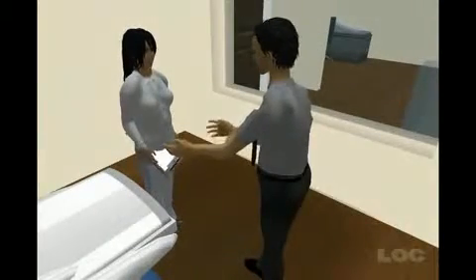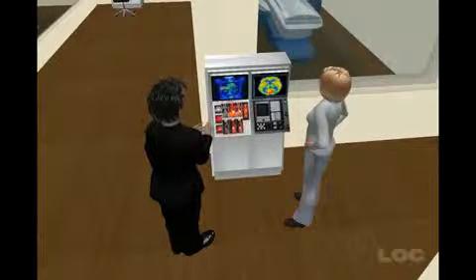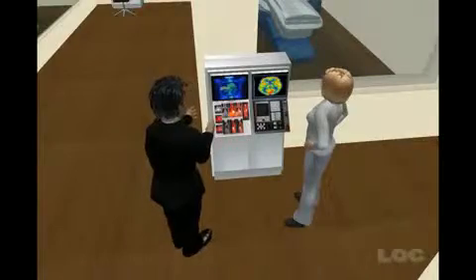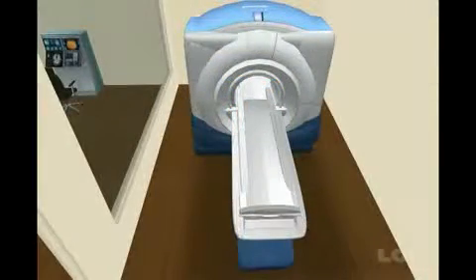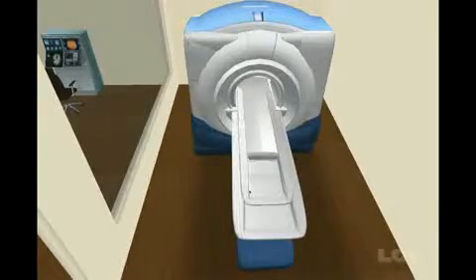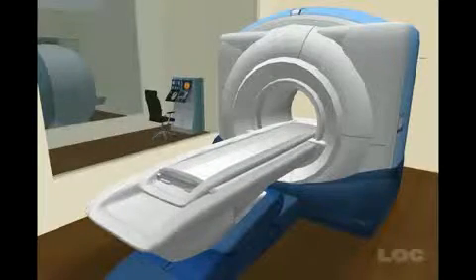PET scans can also be helpful after treatment for a cancer to sort out whether a remaining lump is active cancer or is just dead or scar tissue. The PET scanner also consists of a moving couch that slowly moves a person through a short tunnel. This is a bit narrower than a CT scan, but much wider than an MRI scan, and most people don't find that it causes claustrophobia.